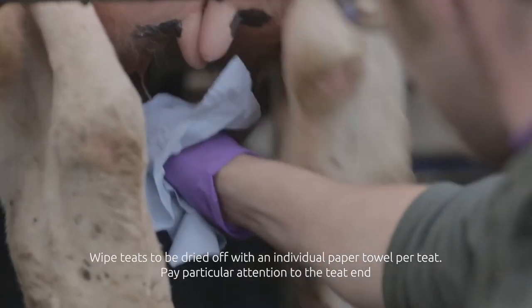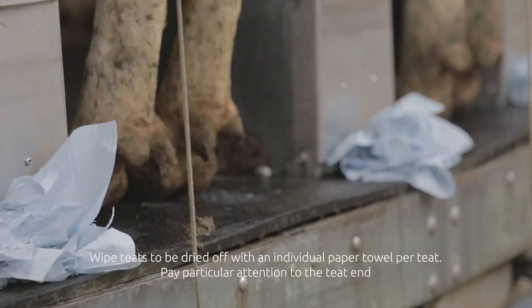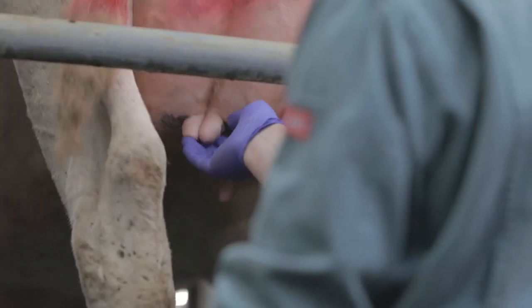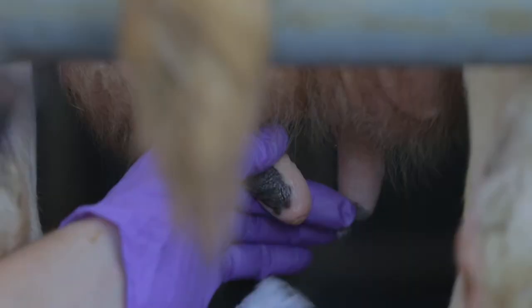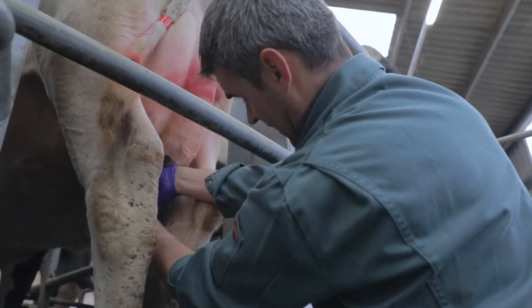The next stage is to aseptically prepare the teats using cotton wool and surgical spirit. We should always prepare the teats furthest away first, then the teats closest to you. Just gently restrain the teat and swab the teat barrel with the cotton wool swab. You can see the teat is nice and clean.